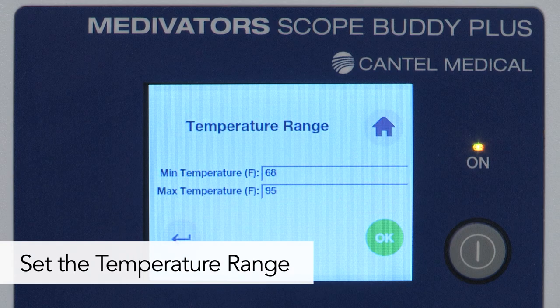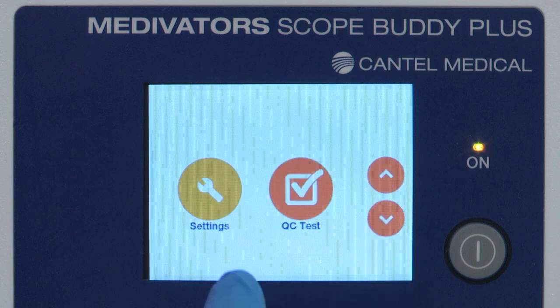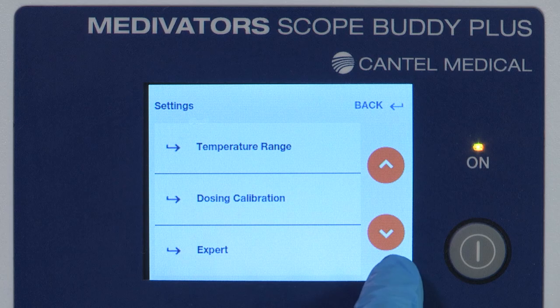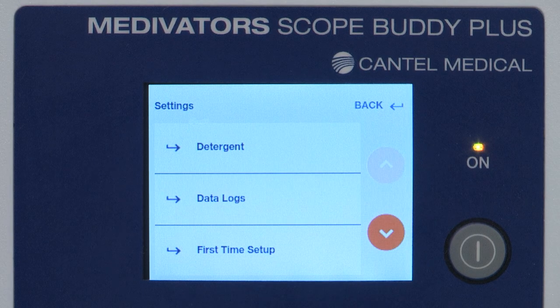When using temperature monitoring, the default temperature range is set for Intercept Detergent: 20 to 35 degrees Celsius or 68 to 95 degrees Fahrenheit. To adjust the temperature range, press the home button, use the down arrow to select Settings, enter the settings password, and use the down arrow to select Temperature Range. On the temperature range screen, touch inside the min and max temperature boxes to enter the minimum and maximum temperature range of the detergent. Press OK to confirm.